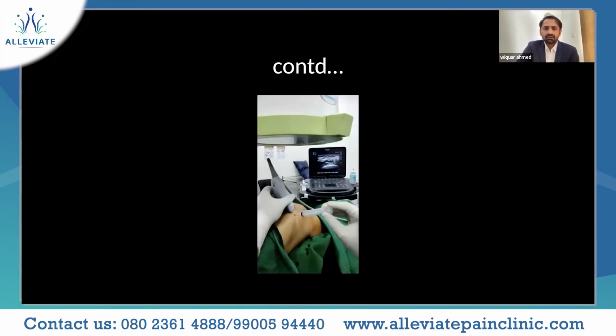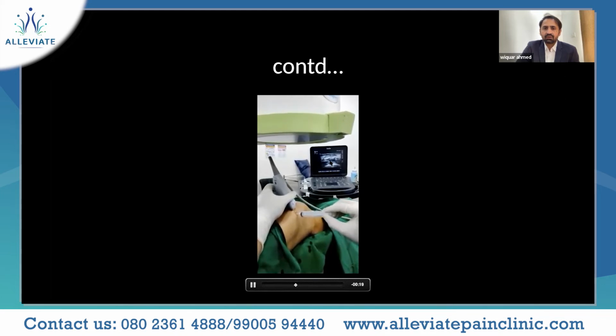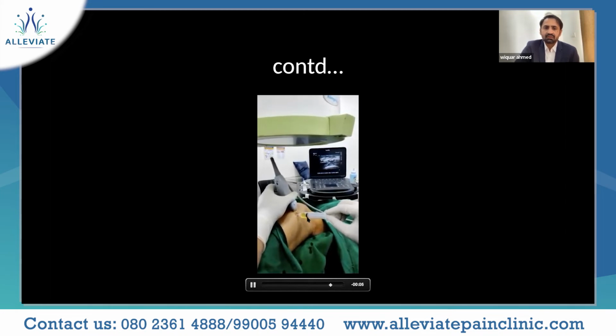This is a video which you can see. We usually use a hybrid technique. This is the suprapatellar area, with a little bit of flexion given. Local has been given, and you can see the needle there in your suprapatellar bursa, and we are aspirating the fluid. The fluid which is aspirated also has to be sent. Anything you tap out, it's better to send it for examination.